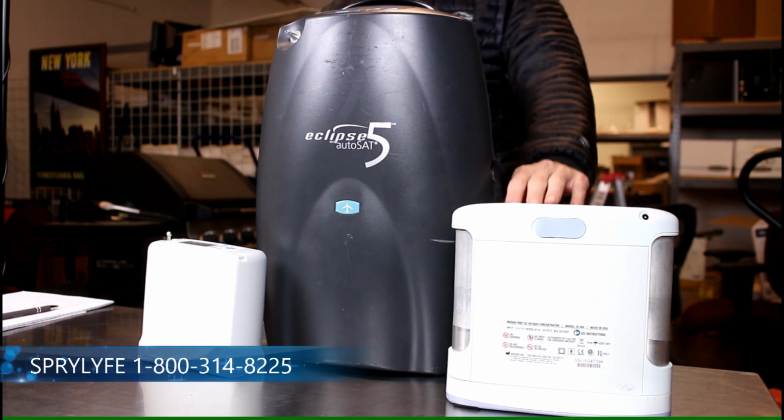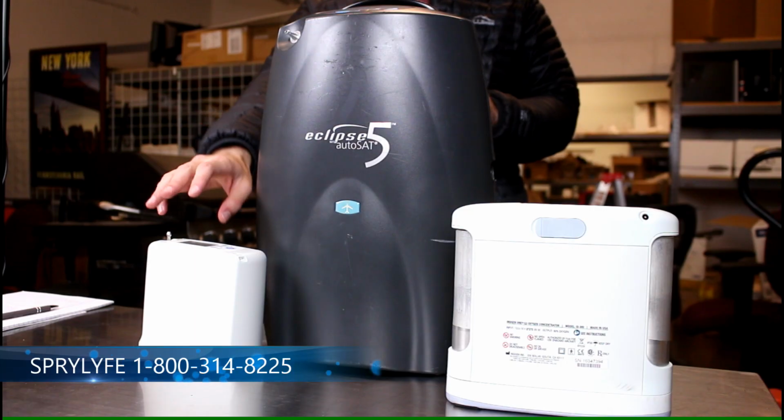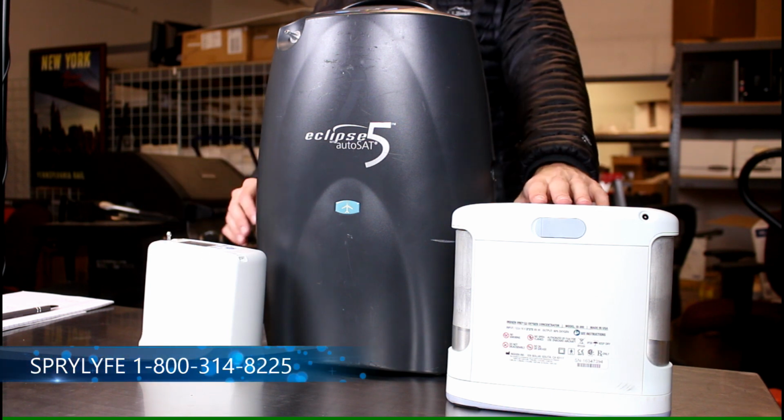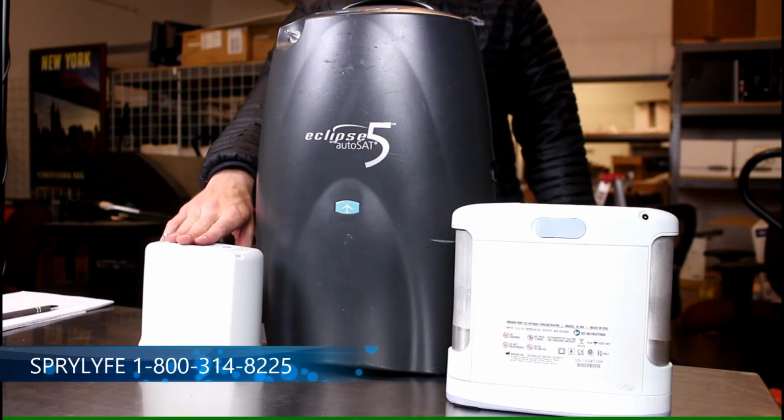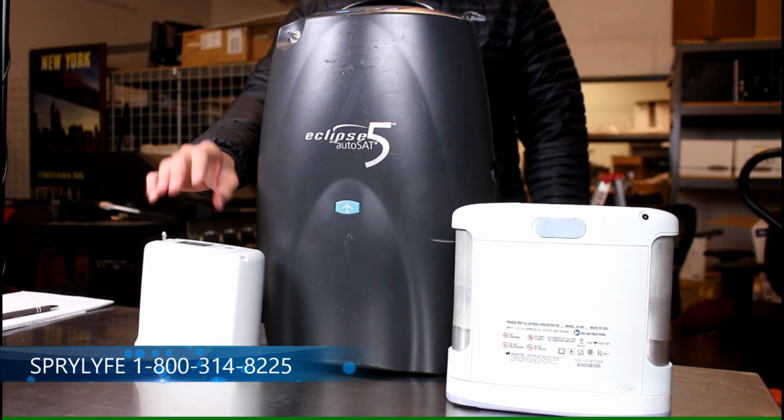Between these 2, if you need a pulse flow of 4 or 5, you're automatically going to need to choose the Inogen One G3. Whereas if you have a pulse flow in that 1 to 3 range, you can choose either of these. The second thing to look at is battery life. Do you prefer longer battery life, or are you stationary a lot? If you're going to be stationary a lot at home, close to a power source where you can have the G4 charging, you're not going to require that external battery, and that's also a factor. But if you're just going out for quick, short trips, the battery life on the Inogen One G4 should not be a problem. And as you can see, this device is very small, compact, lightweight, and easy to take with you. So that's going to wrap up this video on the best 3 portable oxygen concentrators.